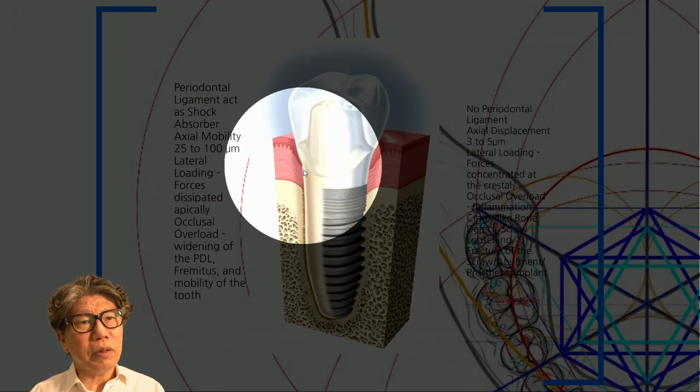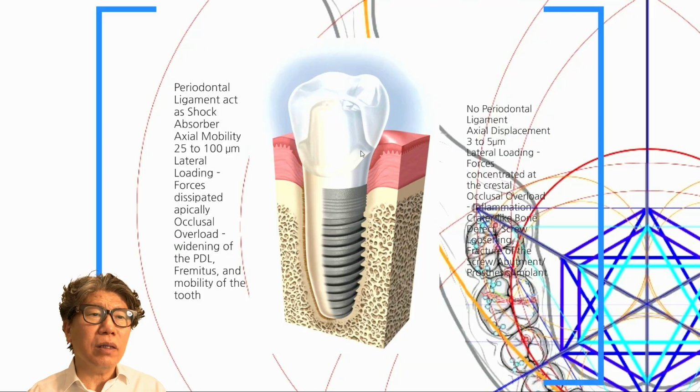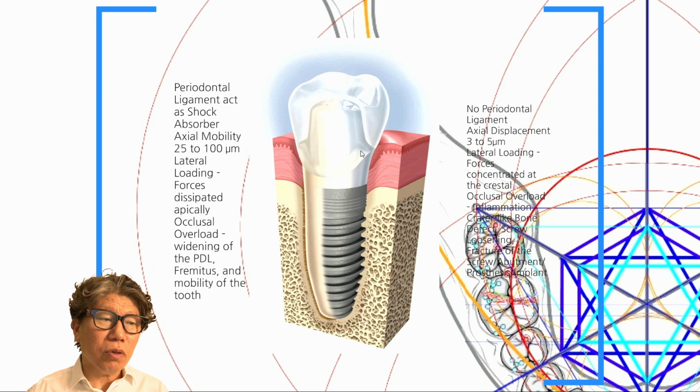The upper part uses 64 alloy, and I think it also affects the implant. So there are quite a few people who see it as somewhat problematic in terms of biocompatibility. So how this will be resolved is unclear.